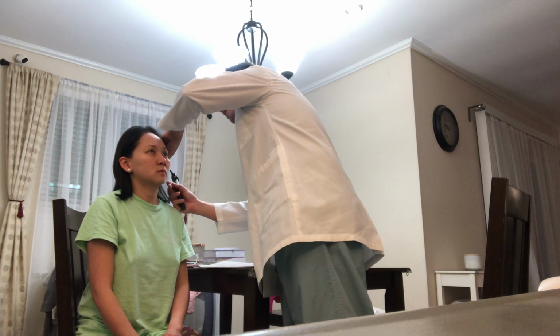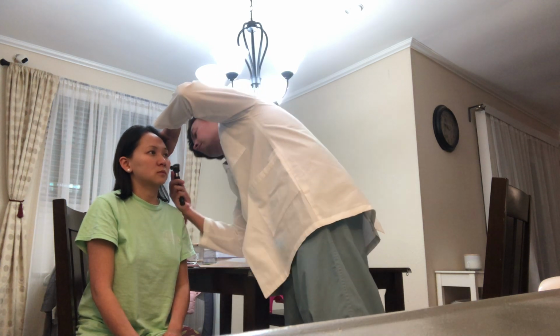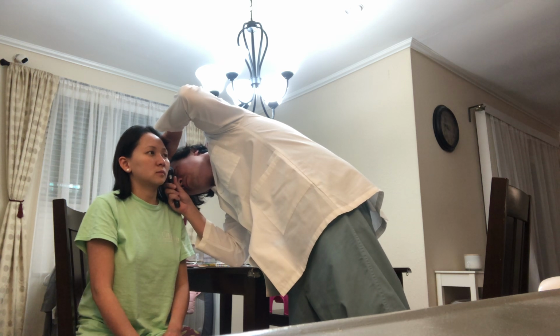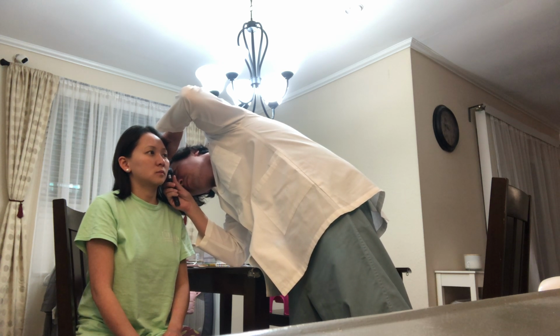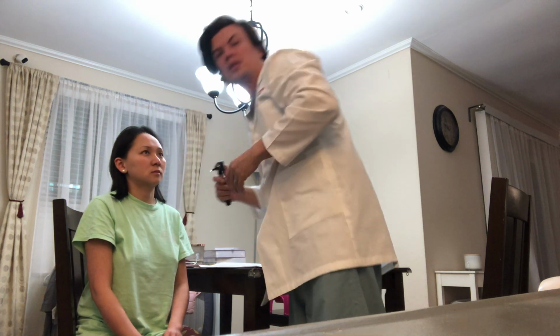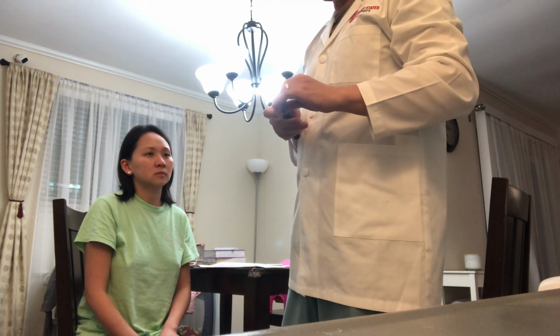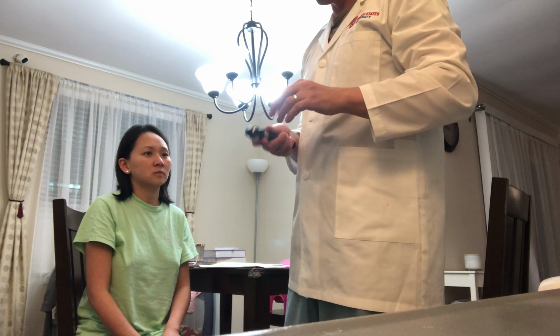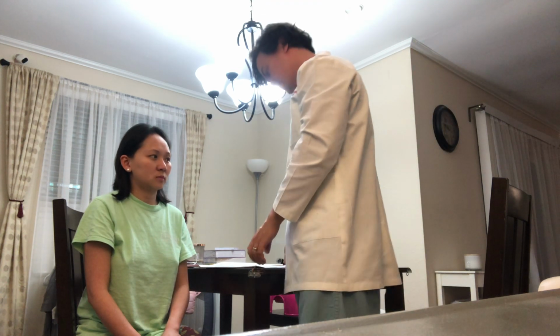For an adult, you pull up and backward. Make sure it's not bulging, and that it's not red. And then you change the scope, and you check the other ear again.